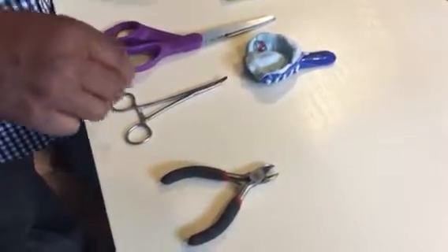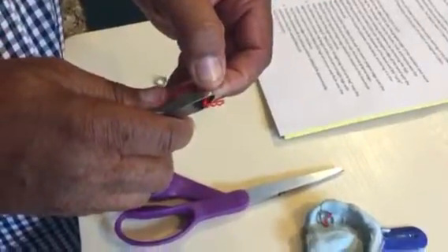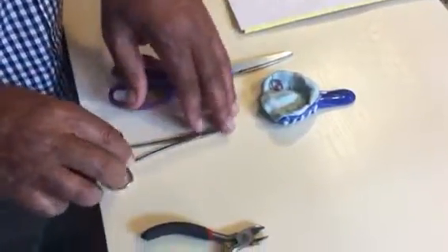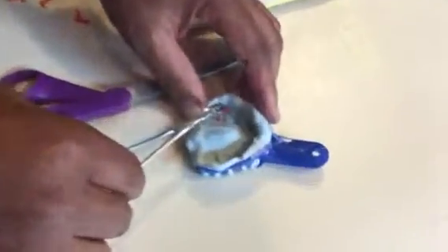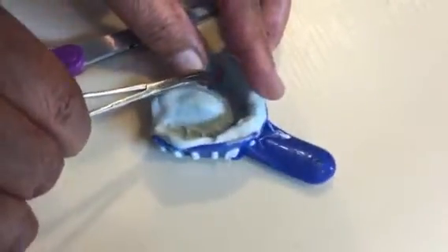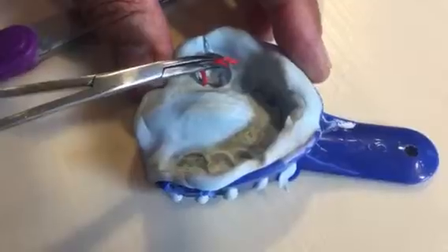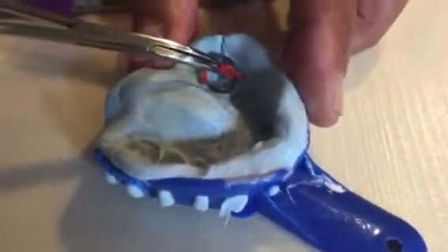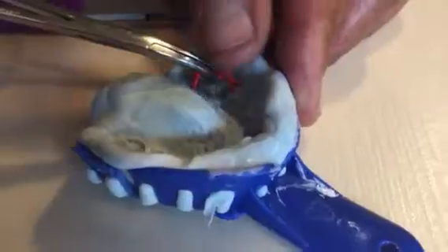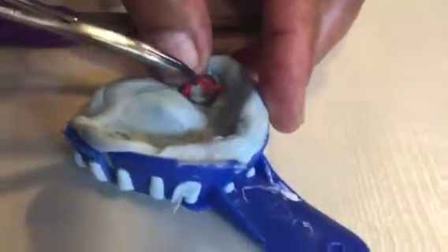Step number 1, cut the horizontal bar of the Dballock in half, such as this. Number 2, with your hemostats, seat half of the Dballock over the gingival portion of the stainless steel band so that the straight leg comes inside and contacts the inner diameter of the stainless steel band, while the curly leg goes on the outside of the stainless steel band. So this should be relatively simple.